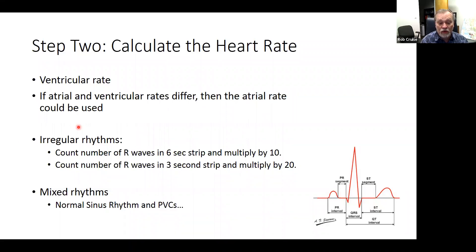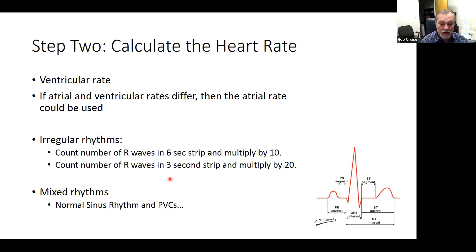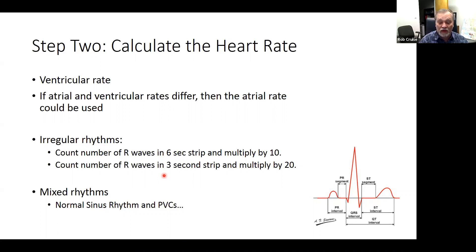If it is an irregular rhythm, we use a different method: count the number of R waves in a six-second strip and multiply by 10. Or you can count the R waves in a three-second strip and multiply by 20 — you'll get the same result. Some places will have you look at your overall rhythm; it might be a normal sinus rhythm with a few PVCs thrown in, so you count the normal rhythm and then note those separately, calling it a normal sinus rhythm with PVCs.